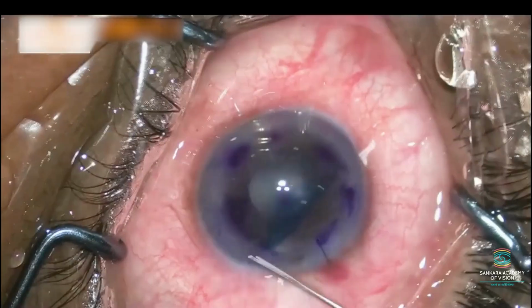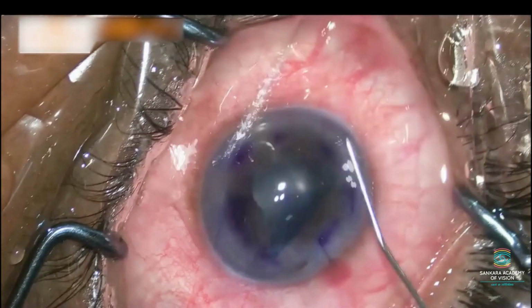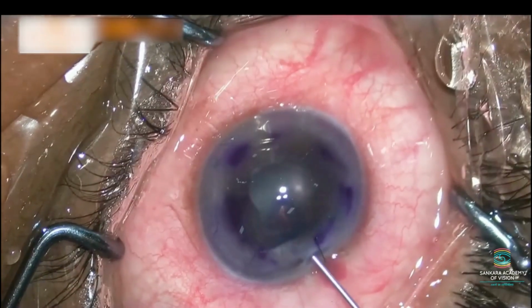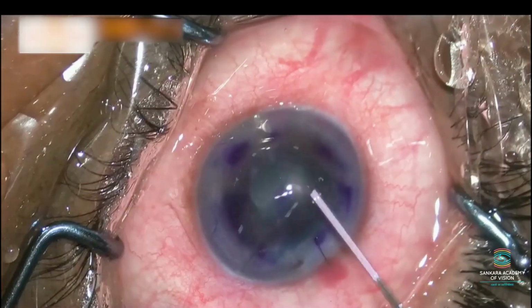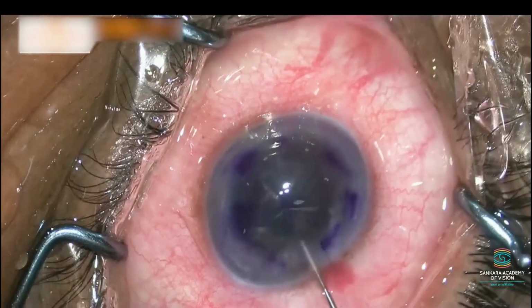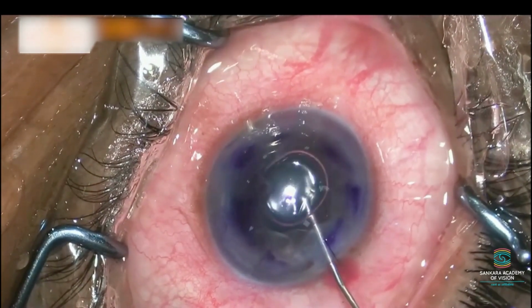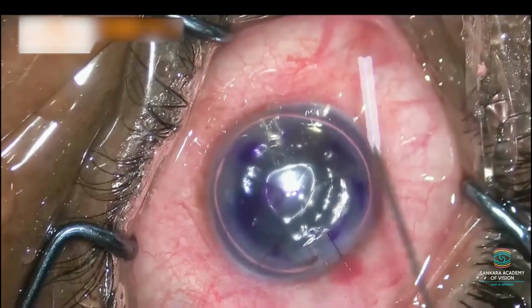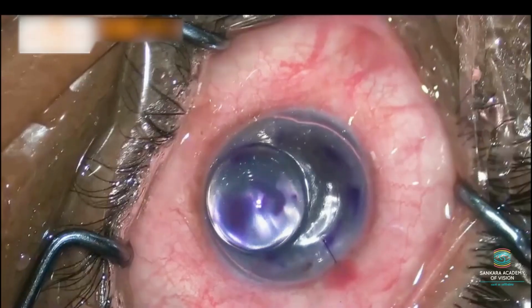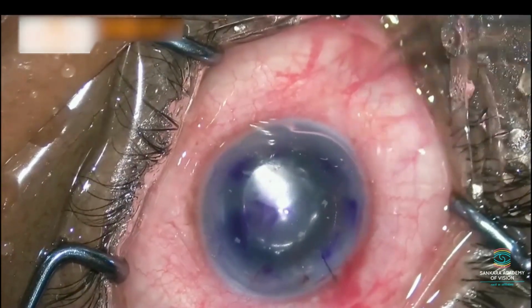Gentle taps are made using a 27 gauge cannula to unfold the graft in correct orientation and center it. Intermittently, the antechamber is shallowed to prevent the re-scrolling of the graft. After ensuring the correct orientation and centration, air is injected in the antechamber to fix the graft. Antibiotic drops are instilled and BCL is applied.